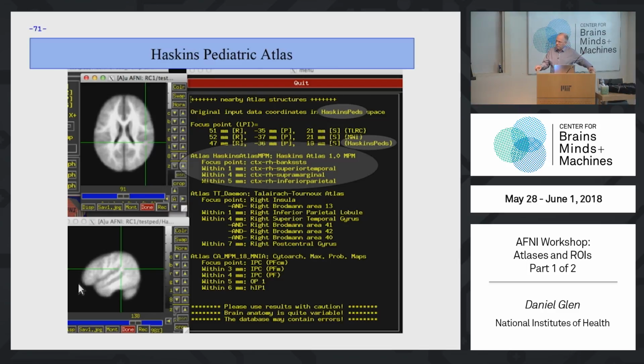The affine iterative seems like it could be a much faster process than nonlinear. It is a nonlinear process. It's still the nonlinear procedure for all of these things, but it's just what do we start with? So in the end, we end up with a reasonable atlas, and we think it's the best one that we could do for that data.